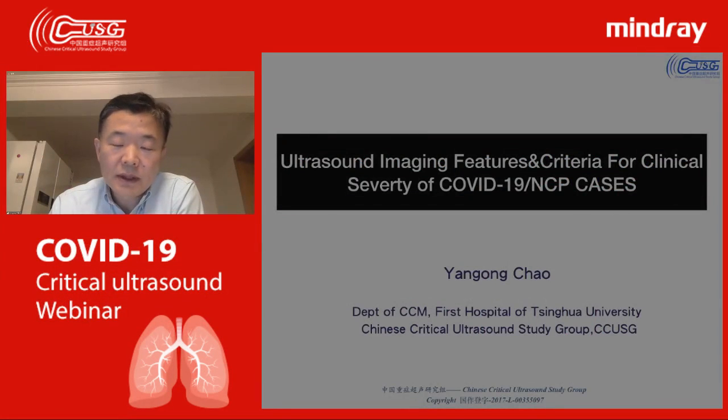I'm Dr. Chao. I think some of you have seen me maybe 2 days ago. I think for you, maybe it's just noon time or afternoon time. Because of this very severe condition, I hope we can transfer some useful information to all of our colleagues. So today my topic is ultrasound imaging features and criteria for clinical severity in COVID-19 and NCP cases. So let's start.